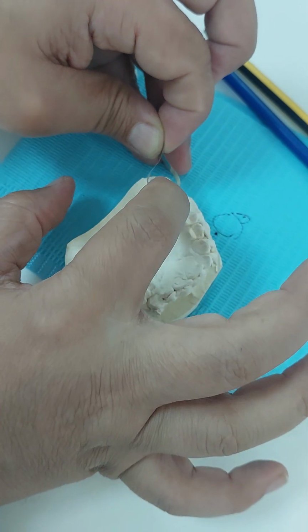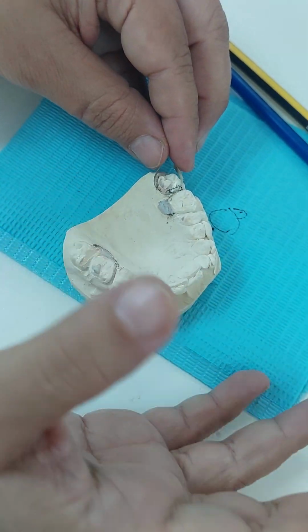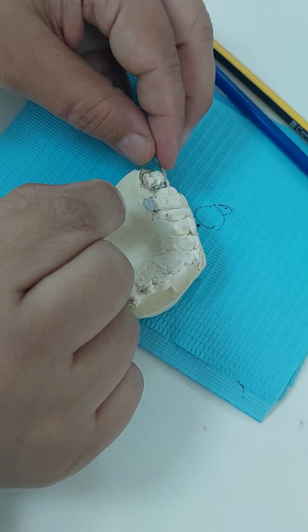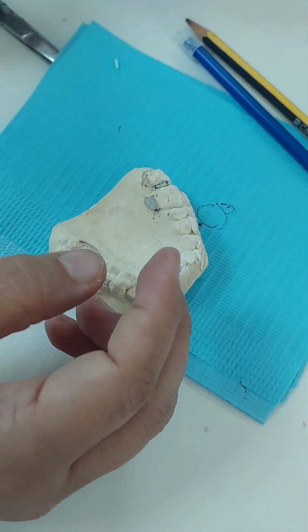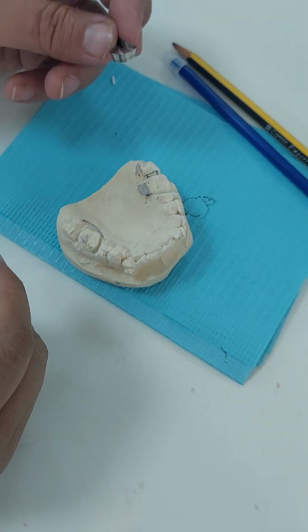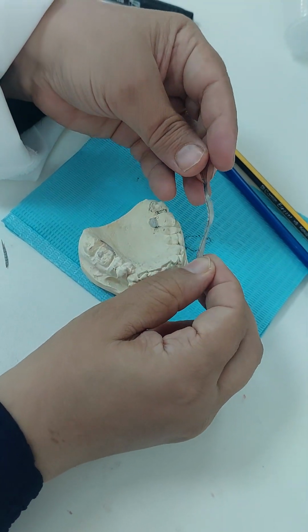So all of these allow me to place the first 1 to 3 millimeters, depending on how deep it is. I place them with a base material as recommended, and then I could go back to the regular matrix, put it in the upper part, and do a filling as usual. Okay, so this is how I create it, and I'm going to show you a paper.